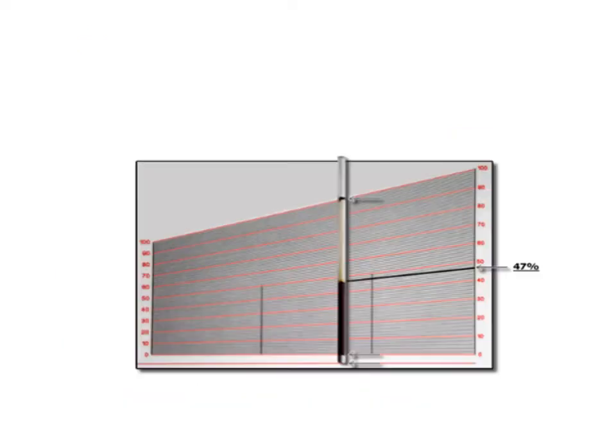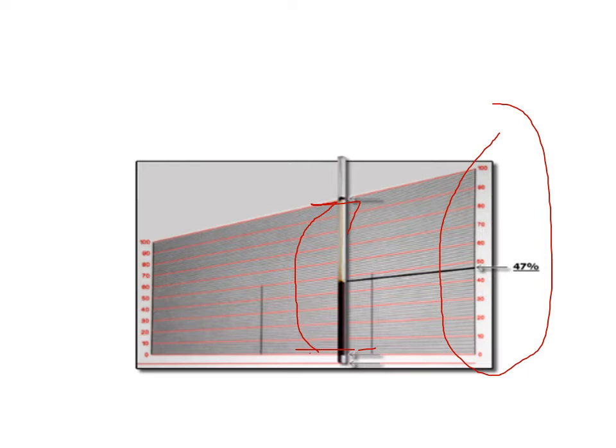The second method references our two measurements, the bottom of the red to the top of the red, and the bottom of the red to the top of the plasma. This time, instead of directly measuring those landmarks, we're going to use them in placing our tube on a CritiCaps card. Take a close look at the CritiCaps card, and you'll notice that each line on the grid corresponds to numbers on the edge. Basically, we're going to place our tube and read a number off this chart.